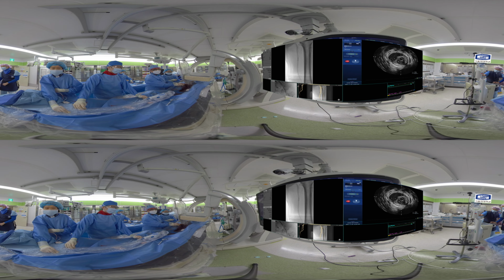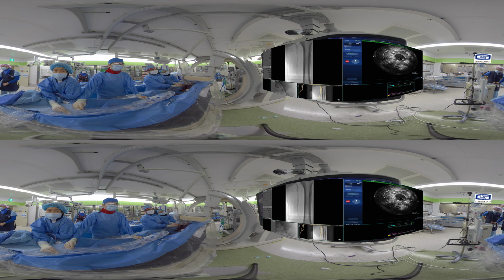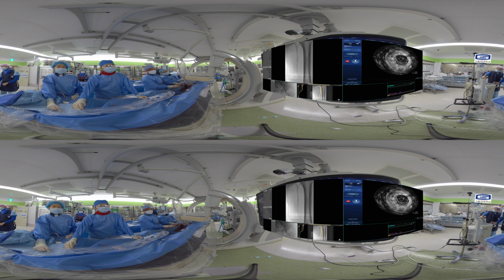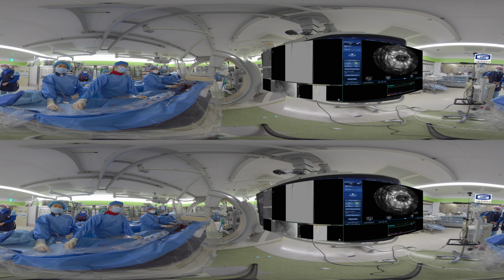After completion of PTA, IVUS showed the recanalized CTO lesions along the PTA site without residual stenotic lesion. The puncture site was closed by a Perclose device. Ankle brachial index after PTA was increased from 0.3 to 0.75 in the left leg.